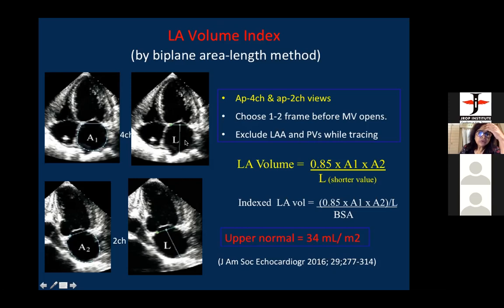Okay. And to the tip of leaflets, tip of mitral leaflets. Not tip of the mitral leaflet, line joined by 2 annulus, medial and lateral annulus. Okay, sir. Tip of mitral valve is here, and L starts from here. Can you see that green line, Meenakshi? Yeah, ma'am. So it is starting from the center of that green line to the superior margin of the left atrium. Okay, thank you, ma'am. Clear? Yes, ma'am, very much.